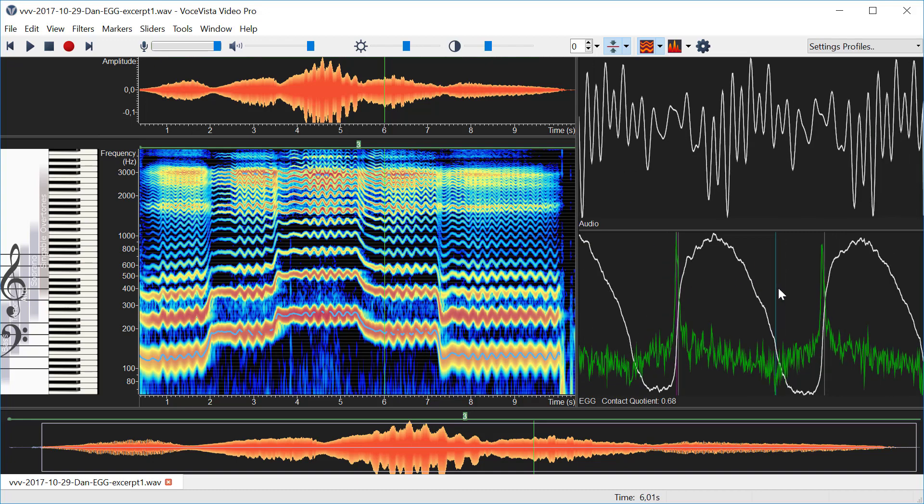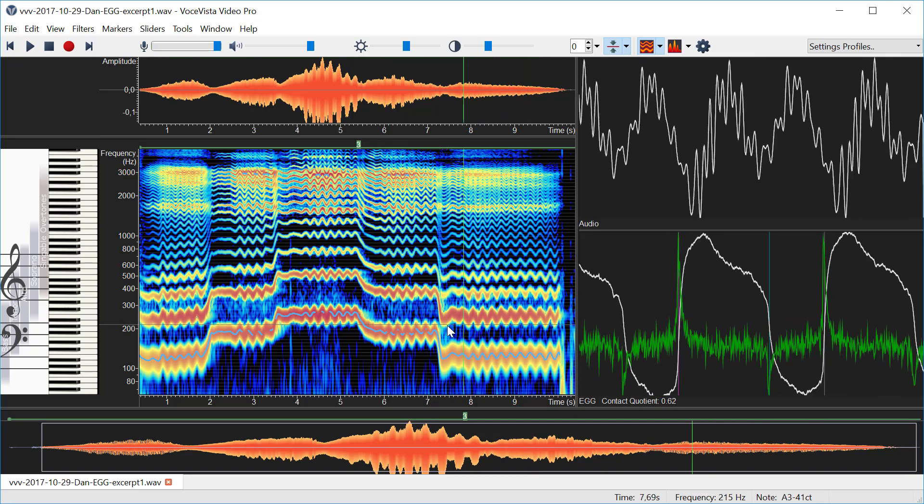So you can see here these two gray lines they mark one period and then the distance between these two lines marks the time between the maximum and the minimum, and then we use that to calculate the closed quotient.